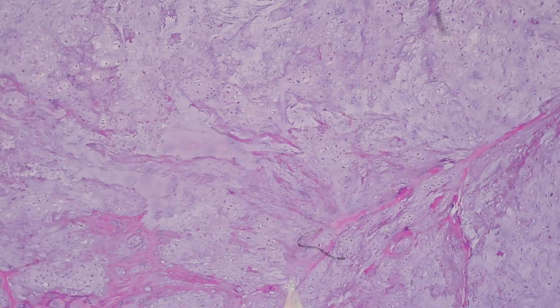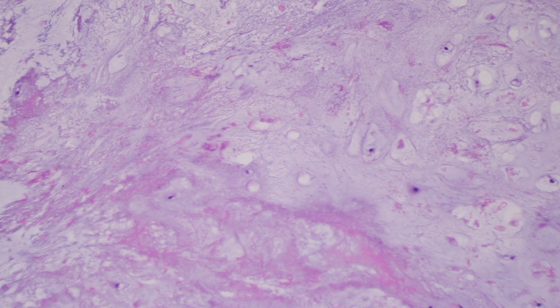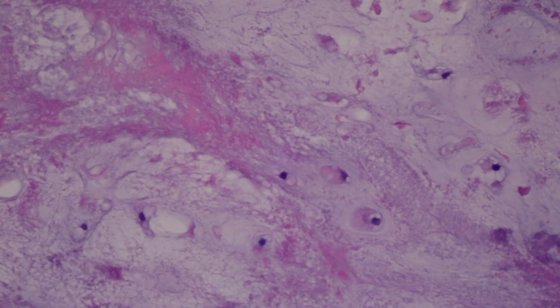So how else do I assess the biological potential of the cartilage? The degree of cellularity. And very simplistically, when you look at cartilage and most of what you see is blue, that means most of the cross-sectional surface area is composed of matrix. That means it's hypocellular. If we are using as our reference, and I encourage you to use as your reference, articular cartilage, it's hypocellular. That is the range that you would expect to see in enchondroma, but there is a range of cellularity in enchondroma. The other thing I pay a lot of attention to are the cytological features of the chondrocytes.